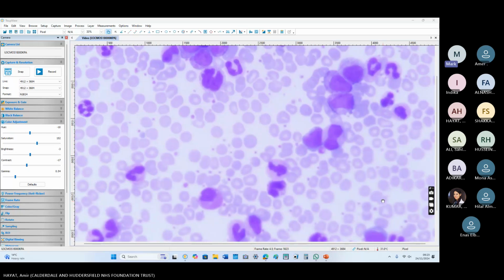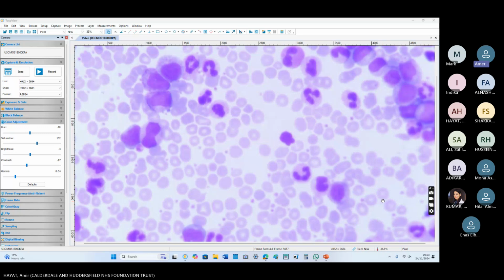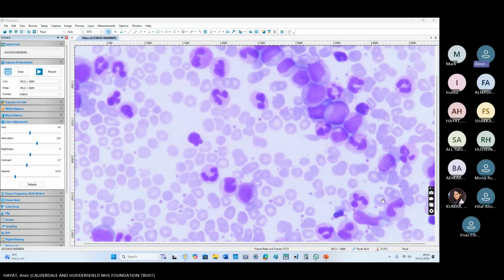Why are there more basophils seen in CML? The 9;22 translocation and mutation result in formation of the whole myeloid spectrum, including basophils and eosinophils as well. This is the only explanation we think for it.